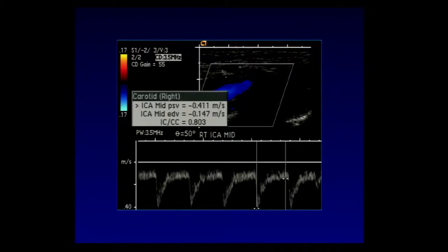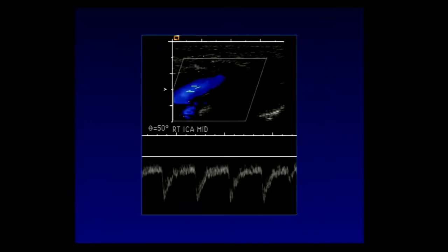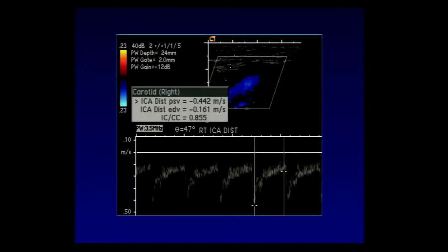But I can't see that on this image, because the box with the calculation goes over it. So my sonographers are so wonderful. They take another one without that table to show me exactly what a good job they did in terms of measuring and the angle. So you need to be able to see the data that they're giving you.